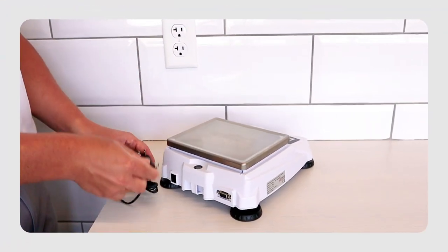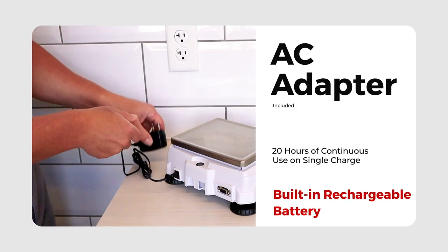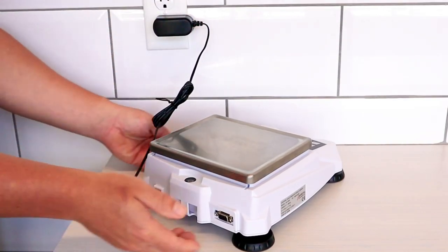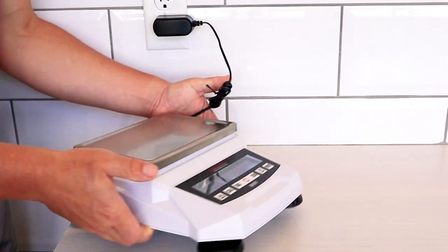The built-in rechargeable battery can operate for up to 20 hours of continuous use on a single charge. It takes approximately 8 hours for a full charge. You can also use the included AC adapter when the scale will be used in a fixed position.